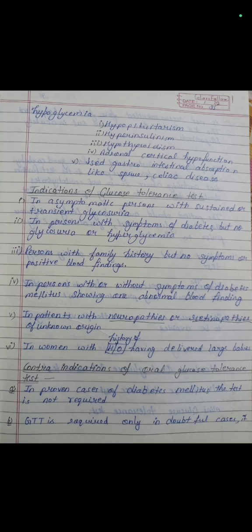Then we will discuss the contraindications of the oral glucose tolerance test. In proven cases of diabetes mellitus, the test is not required, but GTT is required only in doubtful cases. It is not recommended for follow-up of patients. The test should not be carried out in acutely ill patients.